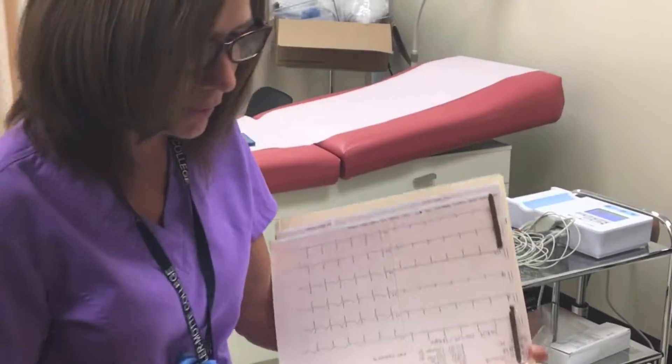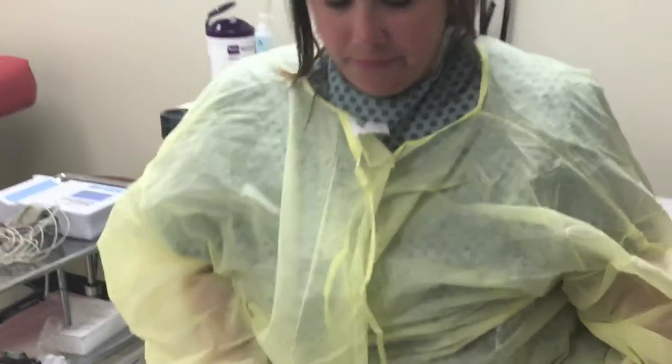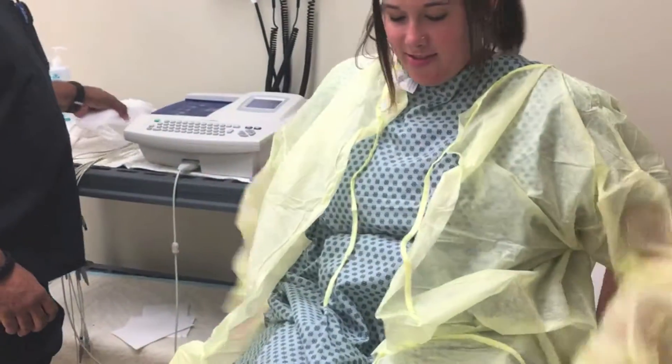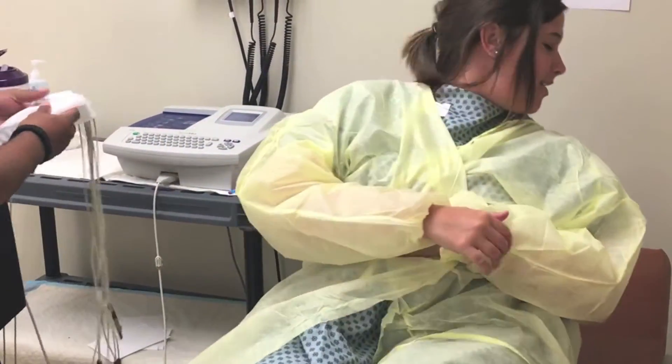So if I could get you to lay back — this will be completely painless. And just lay back; is this your first time?